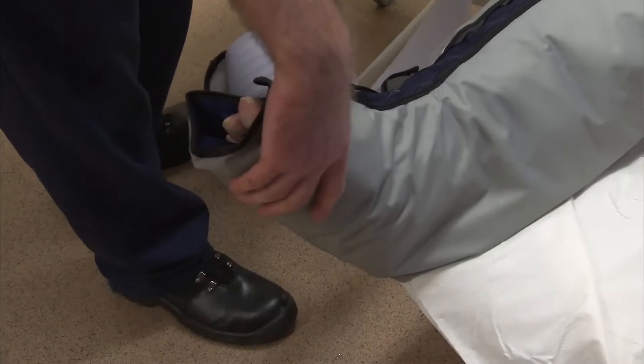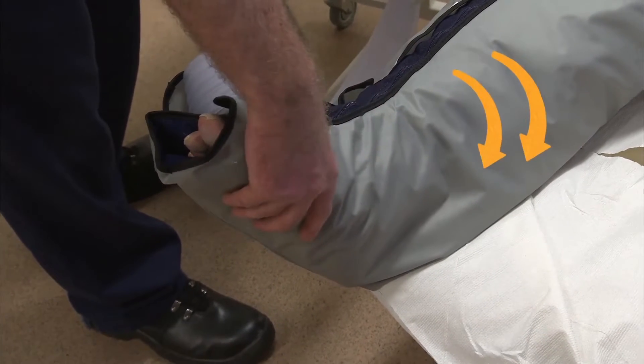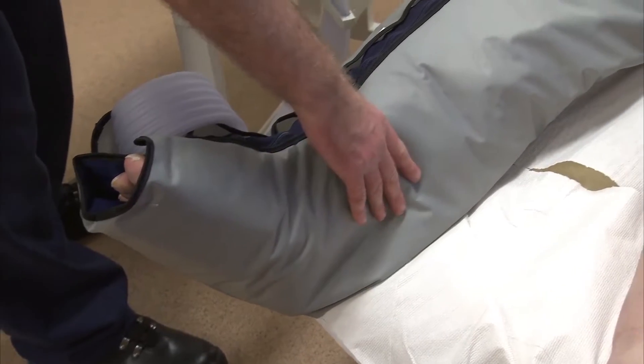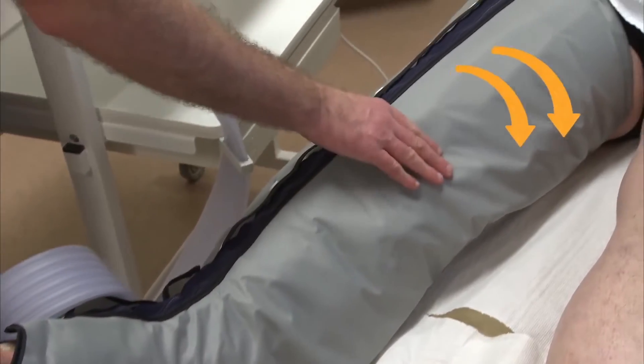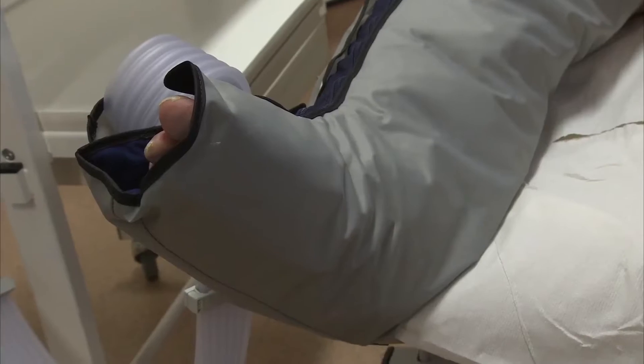What you're going to feel is like a pneumatic massage. It starts by the toes, and basically you've got chambers in here, and they fill up with air, and they start massaging the leg until it gets up to the thigh, and then it starts up again. So we're just going to turn it on for you now. Like waves basically — they start down the bottom and gradually build up the limb until they get to the top, clearing and moving the fluid up.